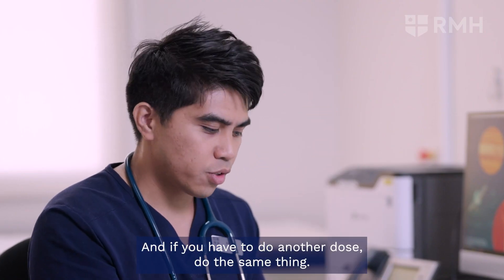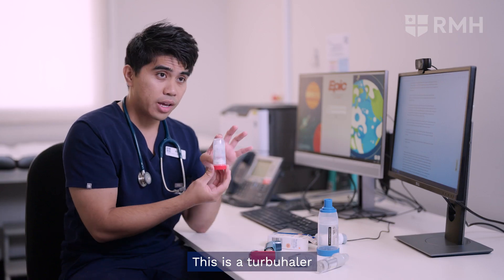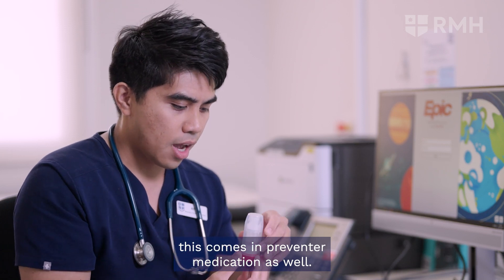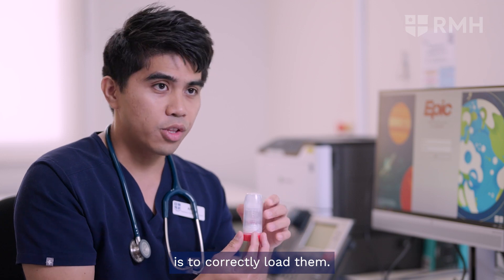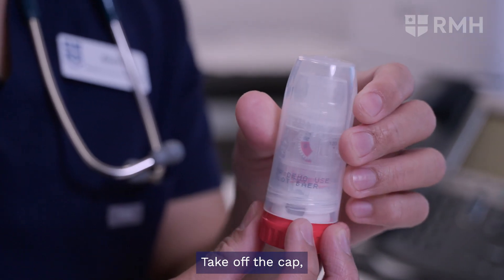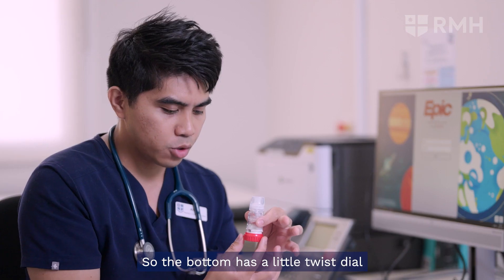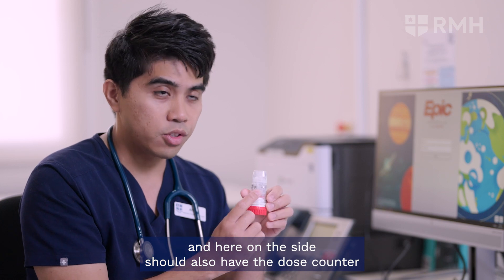If you have to do another dose, do the same thing. This is a turbohaler — it comes in preventer medication as well. What's important with these devices is to correctly load them. Take off the cap, twist and remove. The bottom has a little twist dial, and on the side there should also be the dose counter.